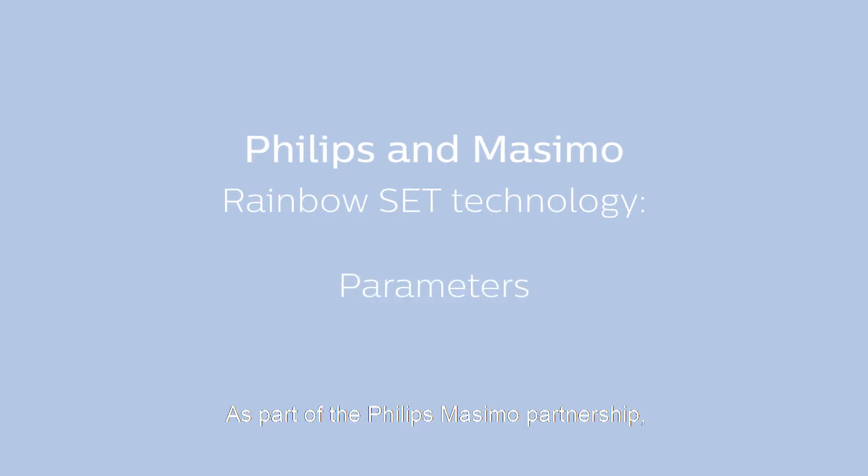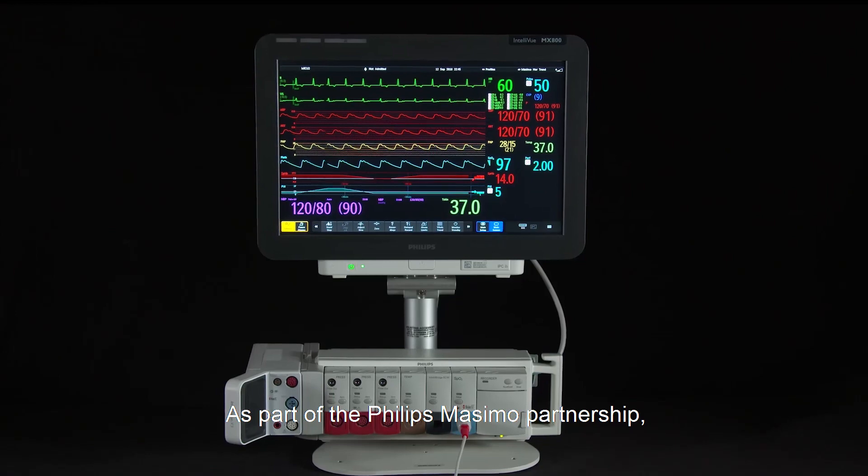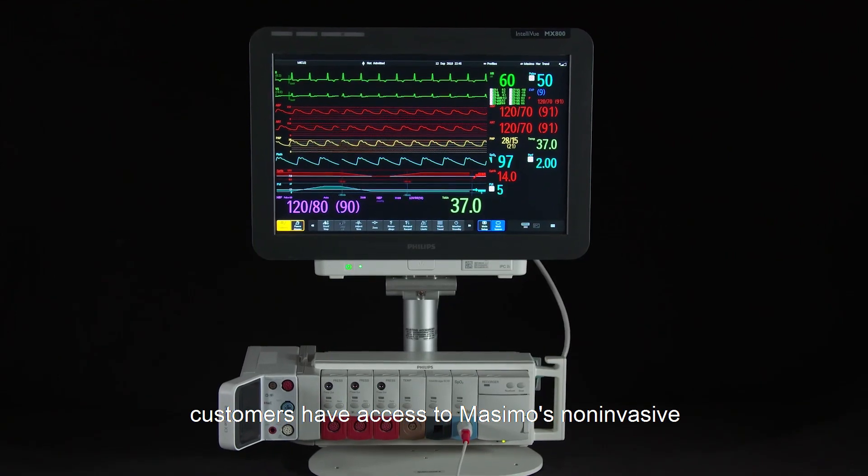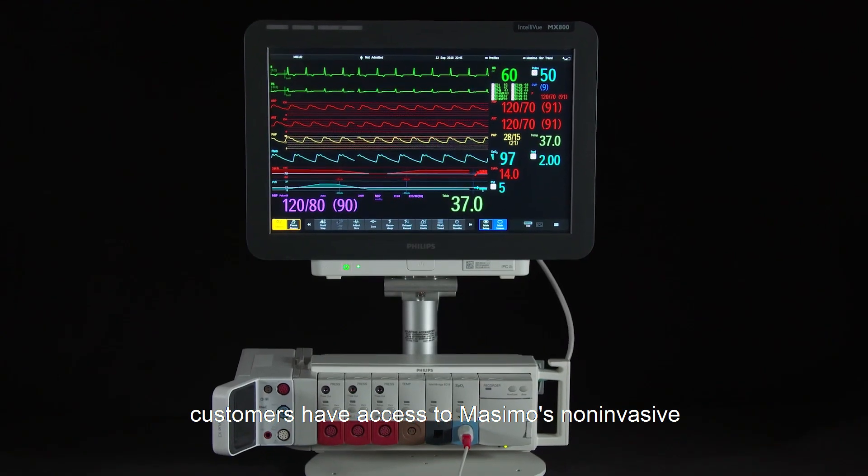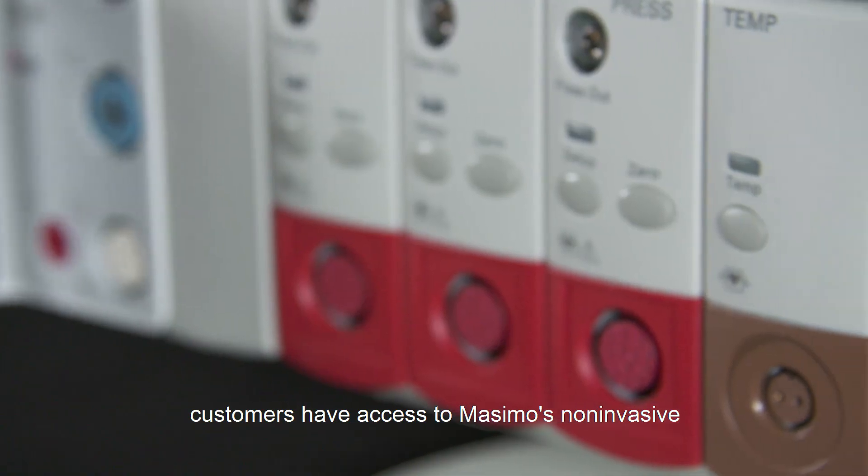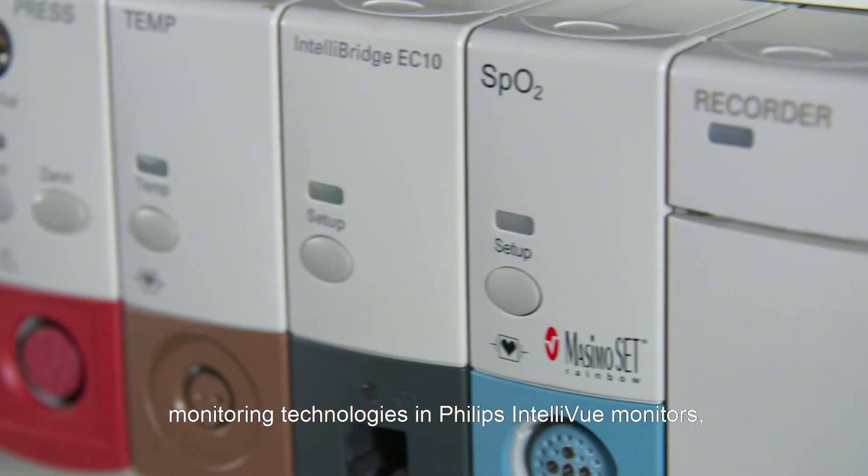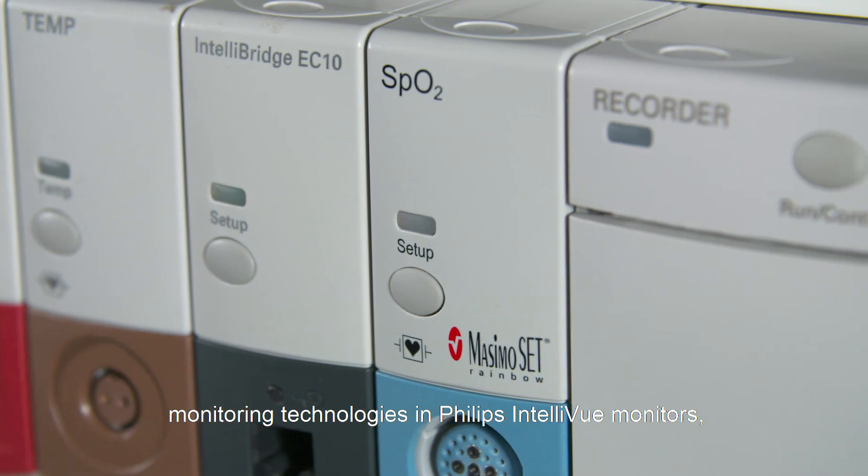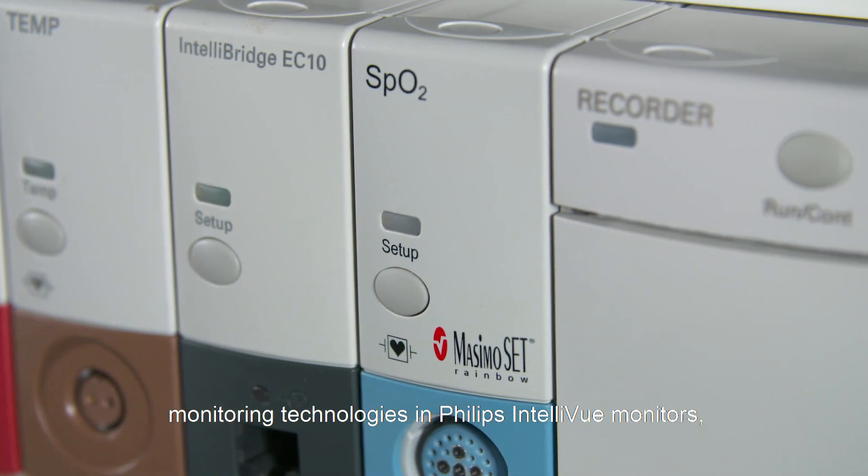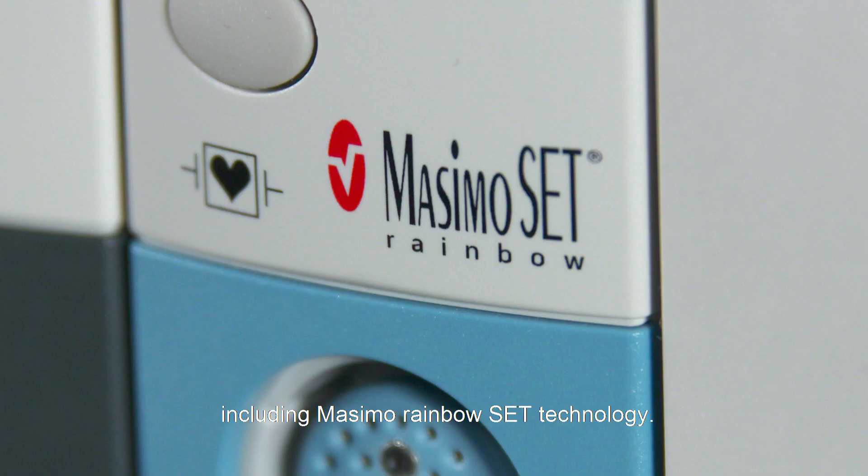As part of the Philips Massimo partnership, customers have access to Massimo's non-invasive monitoring technologies in Philips Intelliview monitors, including Massimo Rainbow Set technology.